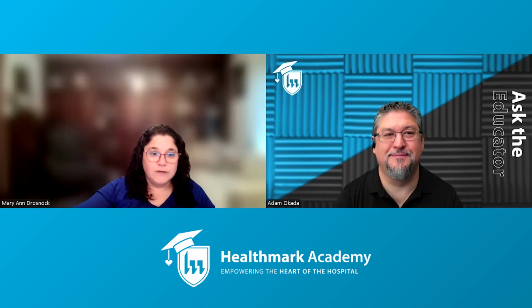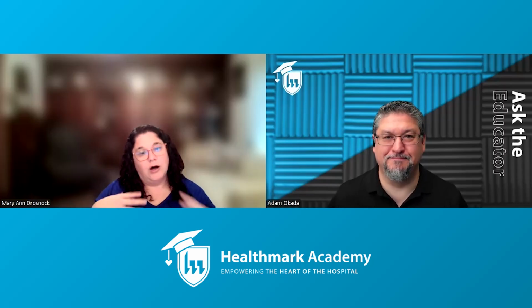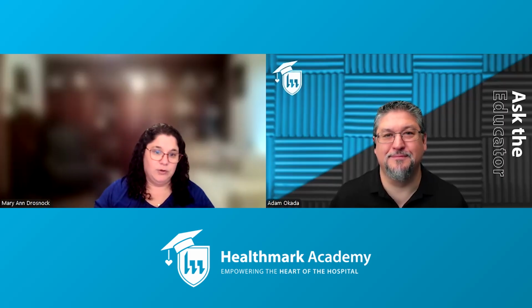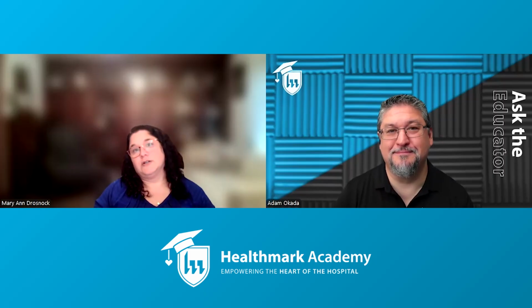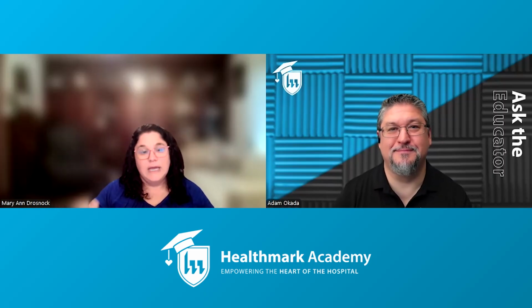That's in the IFUs too, but a different IFU, Adam. That's in your pre-procedure checks, which is in the instruction manual for the scope. So often those of us in the reprocessing areas don't ever even see that manual. It's often a totally separate manual than the reprocessing manual. So in there, they'll tell you to check the water feeding function and check the image on the screen and do all of these things. And one of those is inspect your endoscope to make sure that it's not damaged.